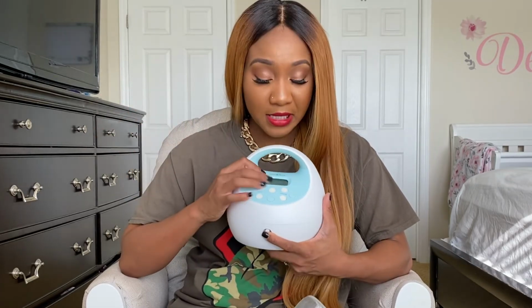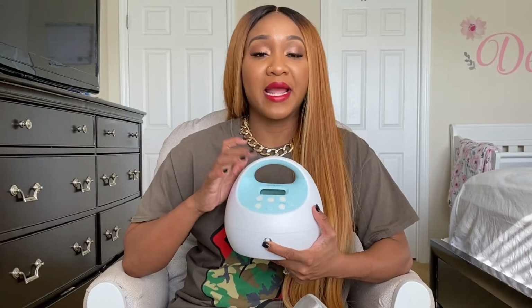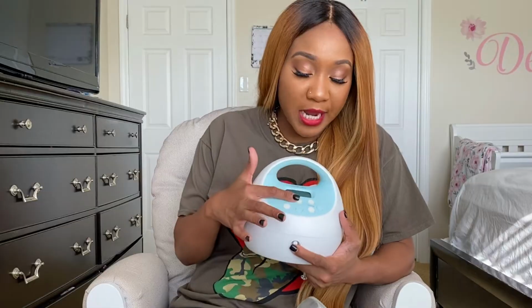Only be in this mode for about 2 minutes, 5 minutes max. Five minutes is really too long, but I would say 5 minutes max. Once you're done with the 2 minutes in this mode, don't power it off, just switch over to your letdown. Letdown is when you see more milk, like you see the milk spraying out. Once you see your milk spraying out, you want to change into letdown mode. I'm not even sure if that's what the mode is called, but we're gonna call it the letdown mode today.